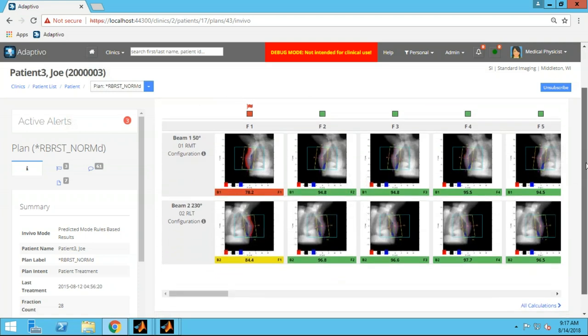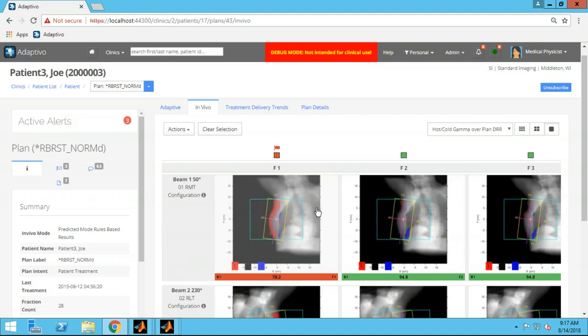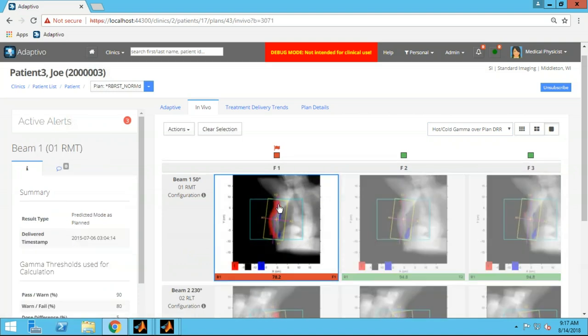Looking at that failure on day one for this breast patient, you can see with the hot/cold gamma we're measuring hot at the skin surface and cold in here at the chest wall. This is the DRR based on the plan — not the cone beam CT and not a portal from the day. So we're anticipating the patient should be in the proper treatment position, and when they're not, you can see these deviations. It's pretty obvious from this one that she was offset — and you know which direction she was offset too.